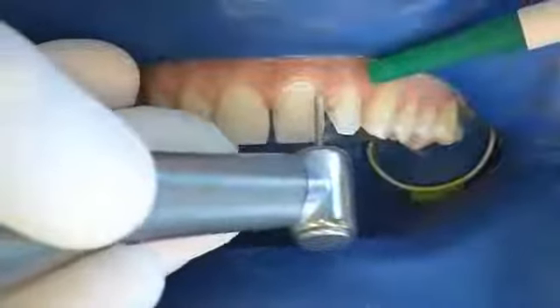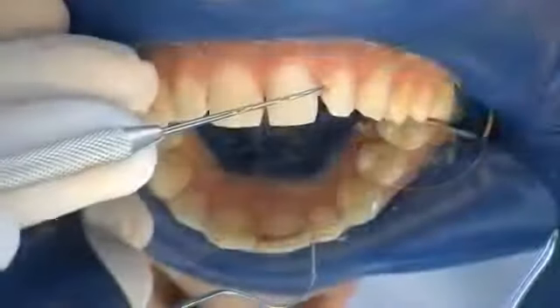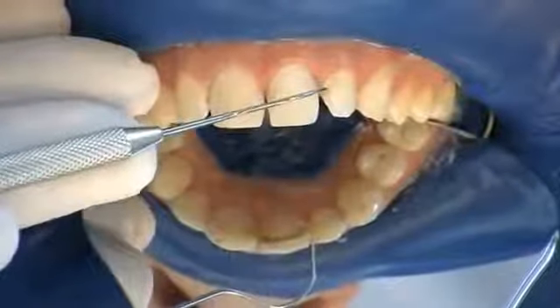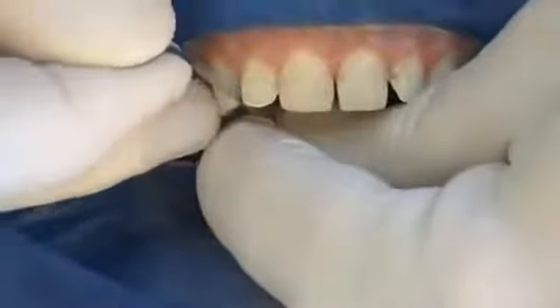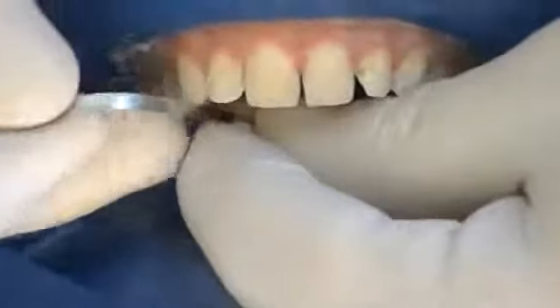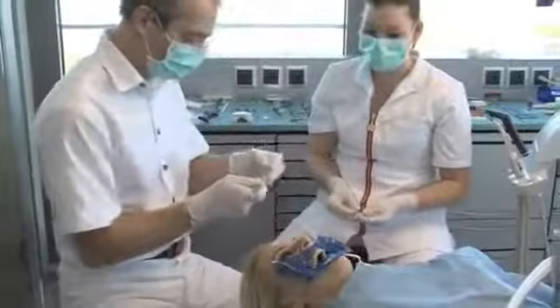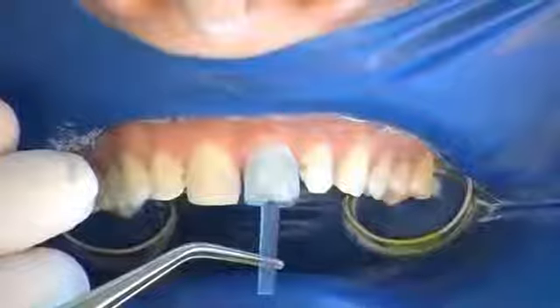Special attention should be given to cervical parts of the enamel. After caries removal, all facial parts of the enamel have been treated; the enamel is also treated interdentally to improve conditioning. Shape and size are rechecked after preparation before the Componeer is removed from its packaging.